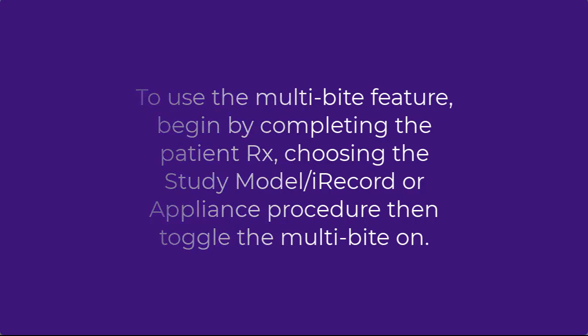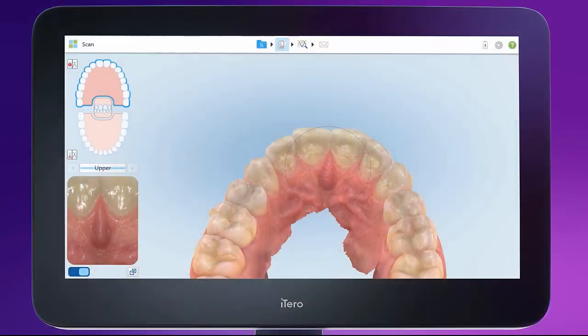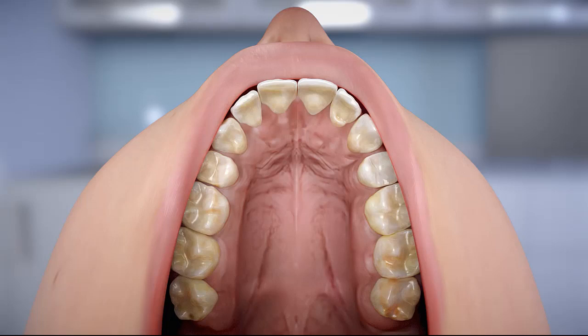You can choose to scan the palate if your case requires this information. To complete the palate, start building the palatal surface on the lingual segment right after completing the teeth. Show the cervical section of the teeth and a portion of the palate. This is especially useful when building the posterior segment of the palate, next to the first and second molars.